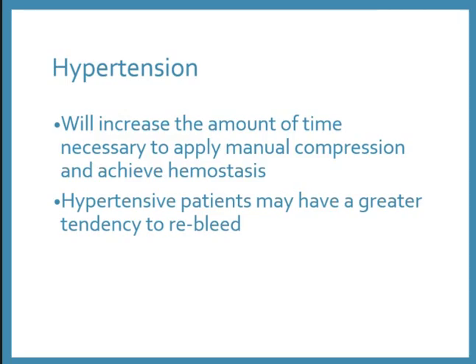My suggestion for this is, one, make sure that your patient's blood pressure is below 140 before you pull. Two, if you have pain medicine, which generally you do not, give them some morphine or fentanyl or something to help make them relax enough where you can pull that catheter, because as the time goes on, they may start to get anxious, their back might start hurting if they're a chronic backer. If you don't have pain medicine on your order set, sometimes you do, sometimes you don't, then I would get pain medicine and give it prophylactically before you even start to pull.